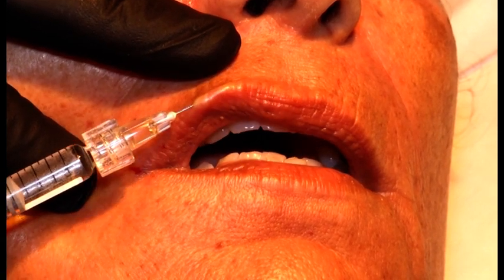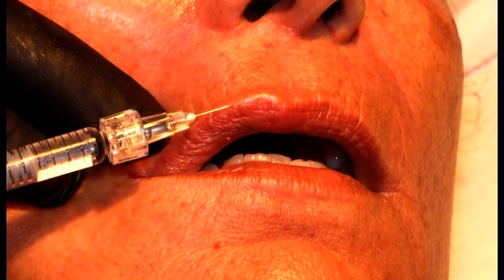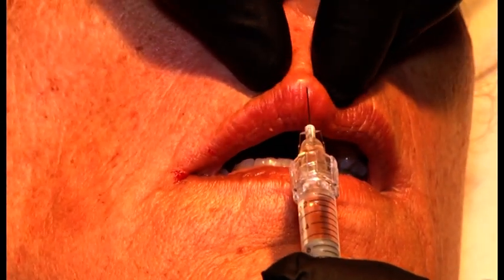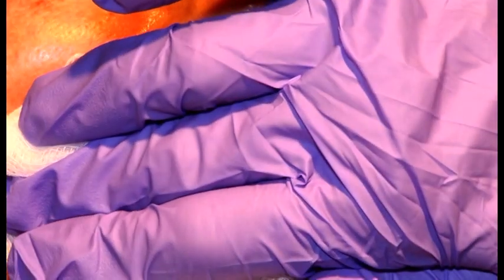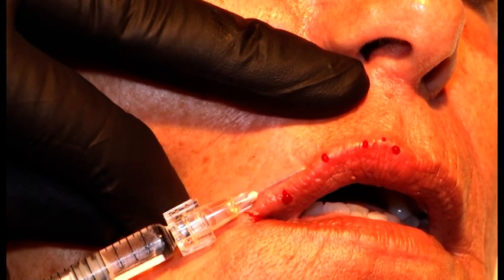And of course there's all kinds of variations that you could use. 3. 4. And 5. Sorry about that. Then of course you can do a little bit of philtrum. And after she breathes in and out, okay, this is without anesthesia, just to show you that it's definitely possible. And now a little bit of blanching in the radial lip lines.